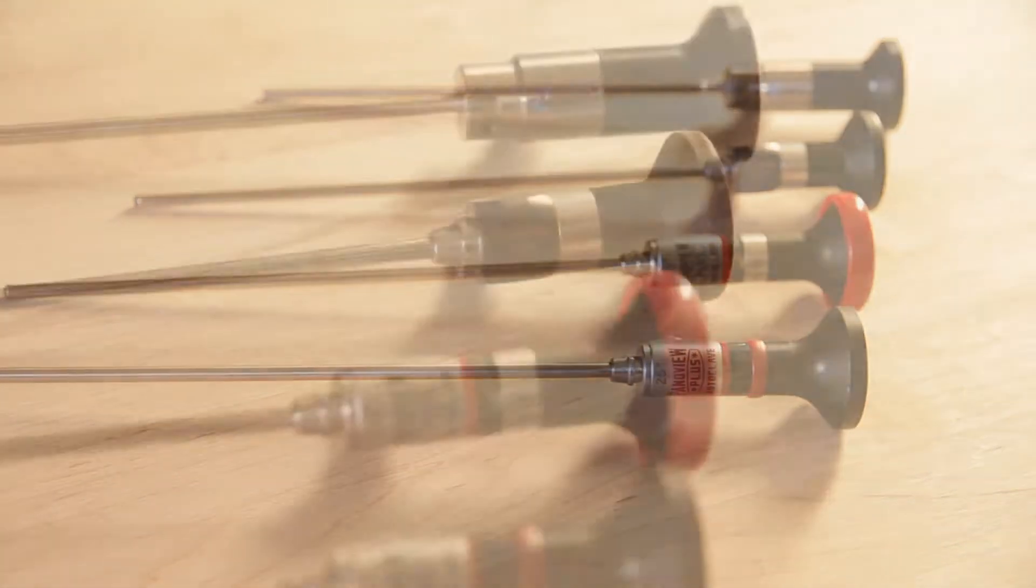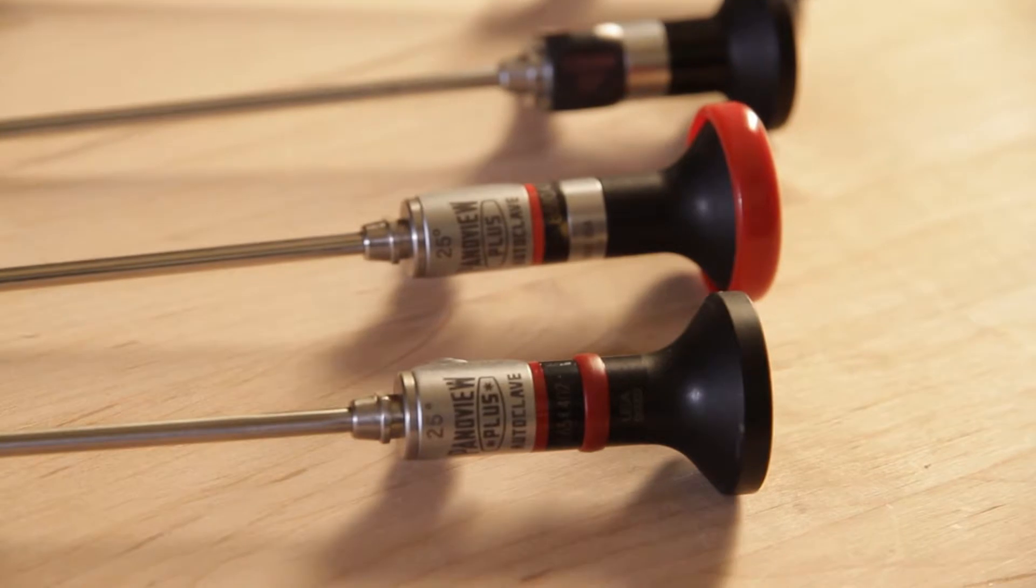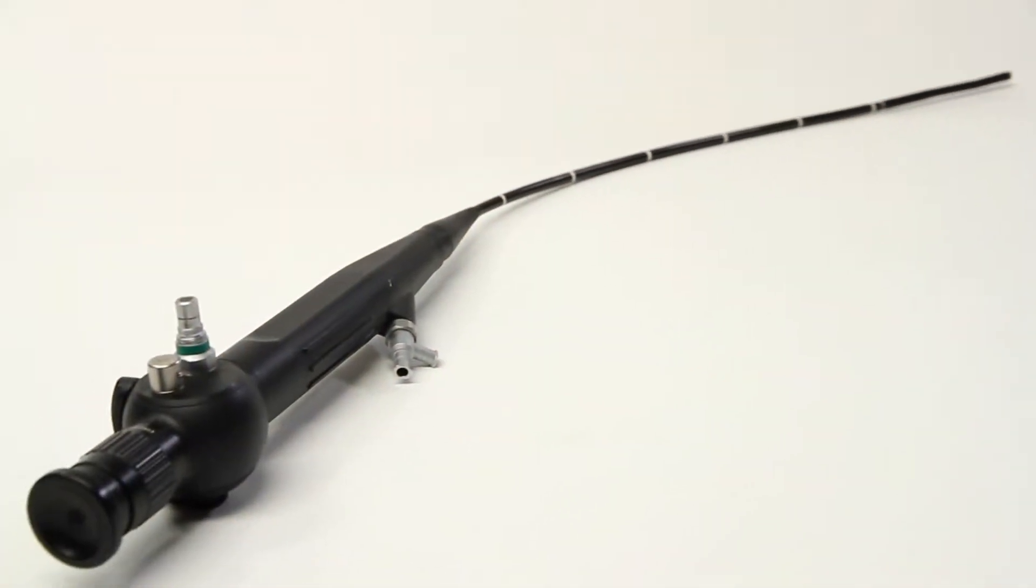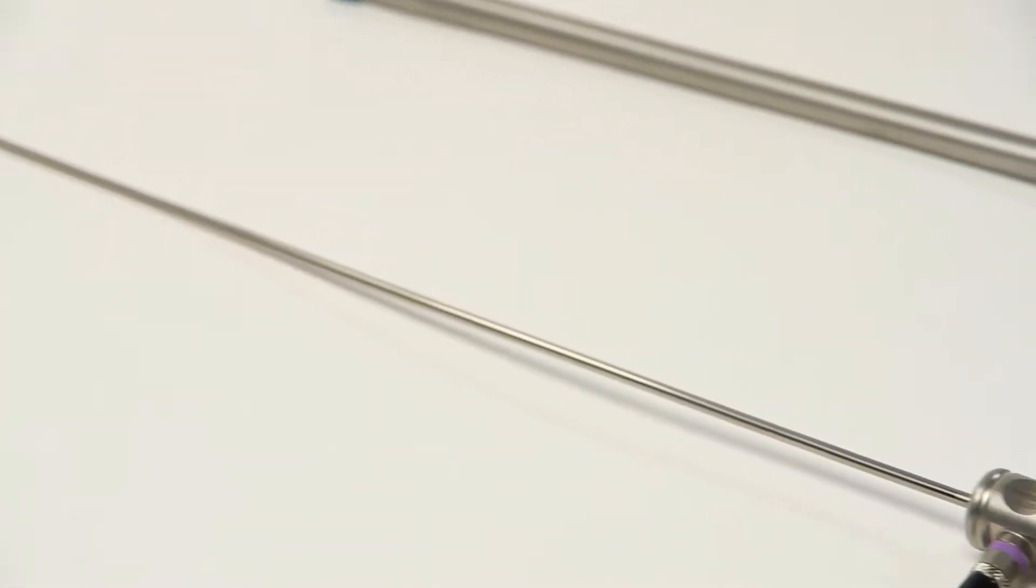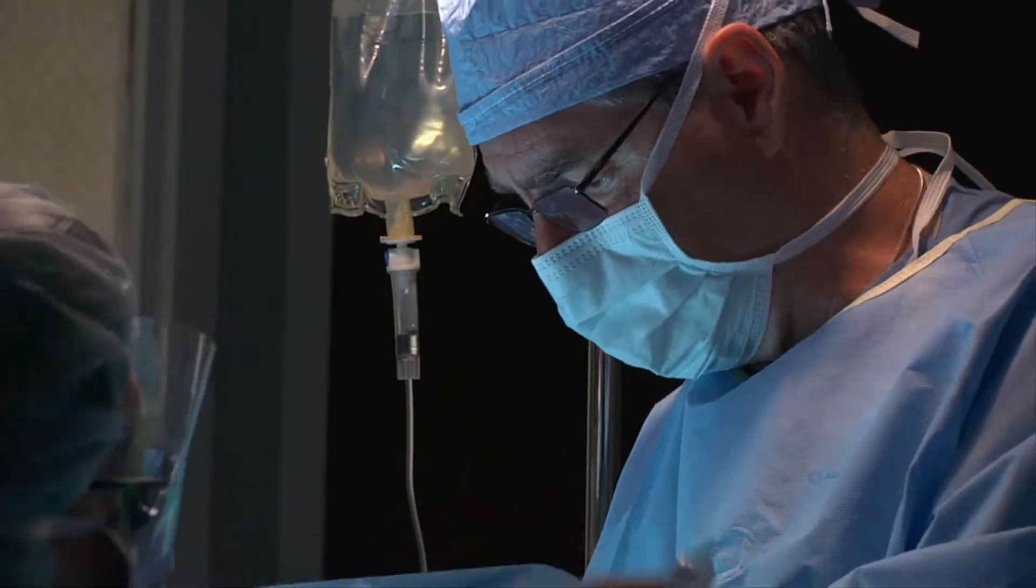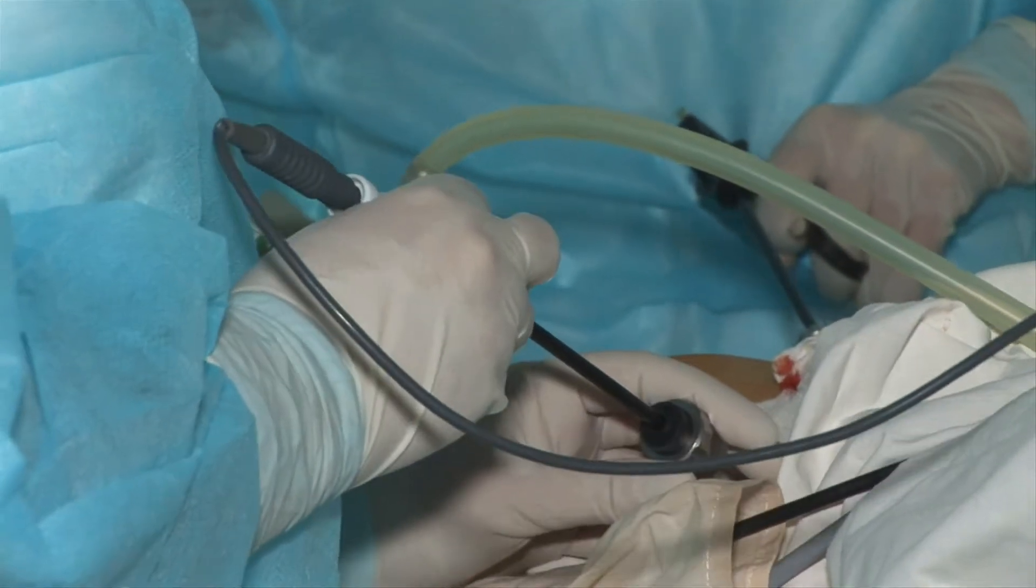Endoscopes have become an increasingly important and integral part of modern surgical procedures. Like any other surgical tool, specific procedures and great care are needed to ensure safety and reliability.